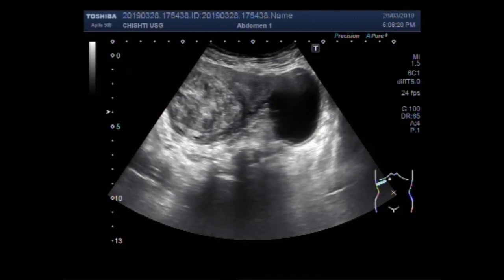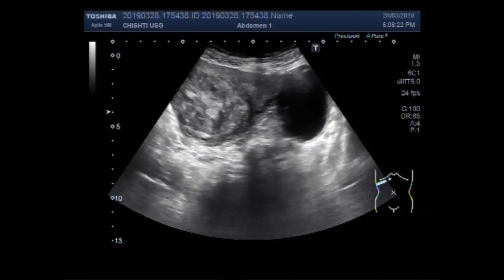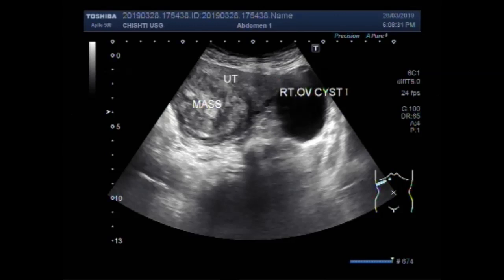Now you can see the right ovarian cyst and the uterine mass. This is the mass, this is the uterus, and this is the right ovarian cyst.